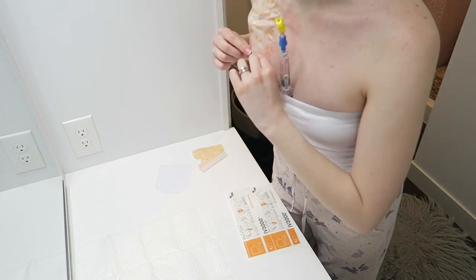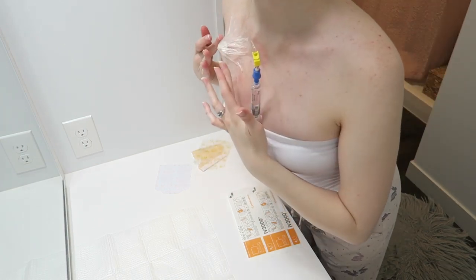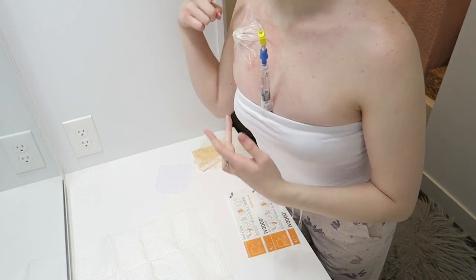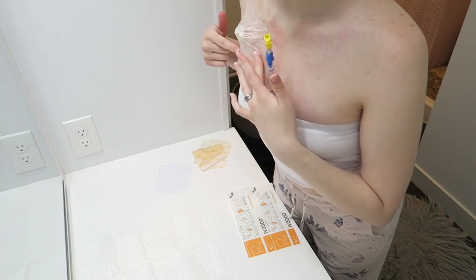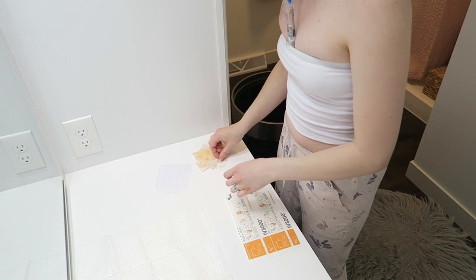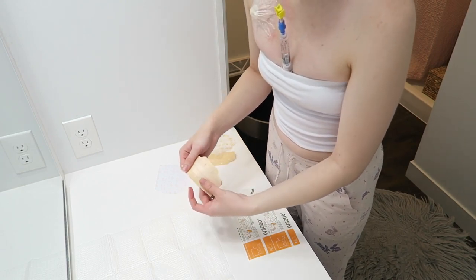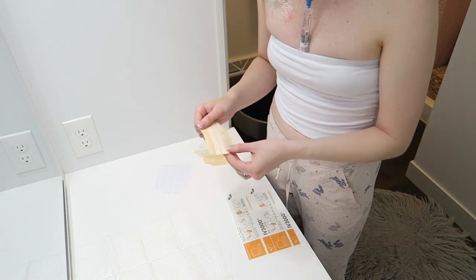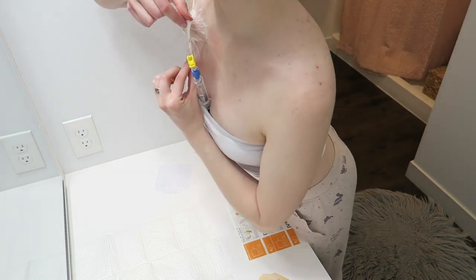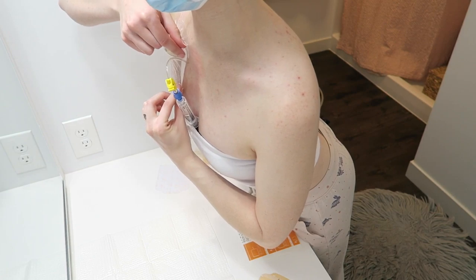So now I'm gonna go ahead and lift this up. And as you can see, I'm a lot more secure now. I have a lot more dressing covering up here and down here. That way it's just not gonna peel up. But the cool thing about these dressings is they come with these strips that you can use. I am slightly irritated by these strips. They're not as good for sensitive skin, but I do use them because they don't bother me bad enough.